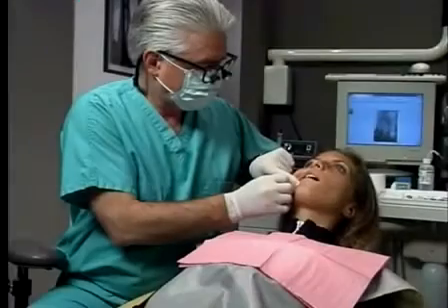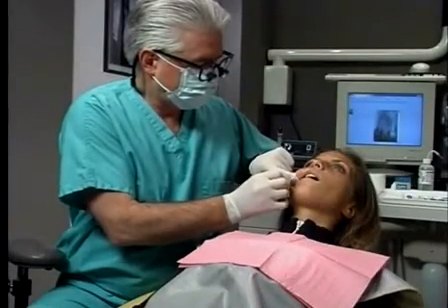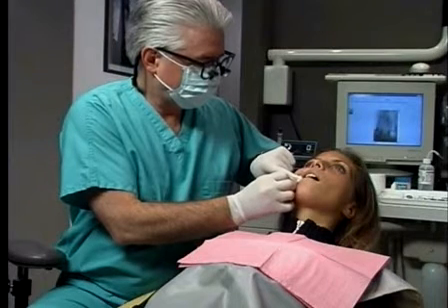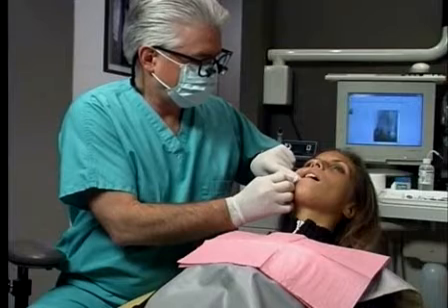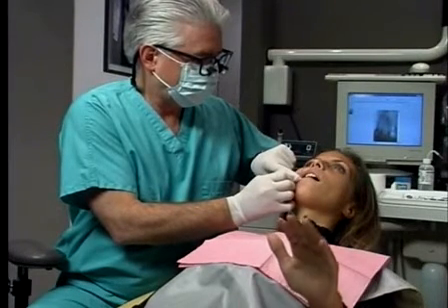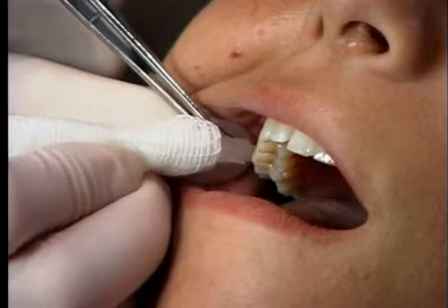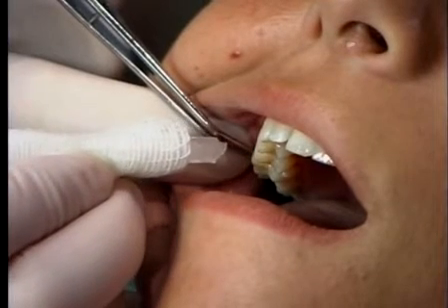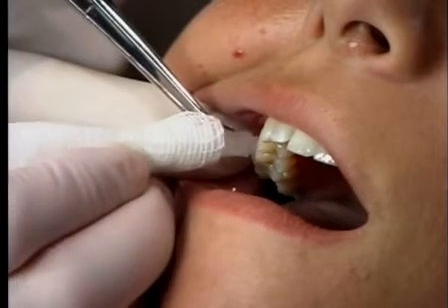The next thing we need to establish are hand signals. We would like to know when the patient first feels the sensation of cold in the tooth, and they'll raise their hand. We want them to keep their hand up as long as the sensation lingers, and we would like them to lower their hand when the sensation dissipates. After establishing a normal baseline on healthy teeth, the dental assistant places a cotton pellet just posterior to the tooth being tested. This prevents a false positive.